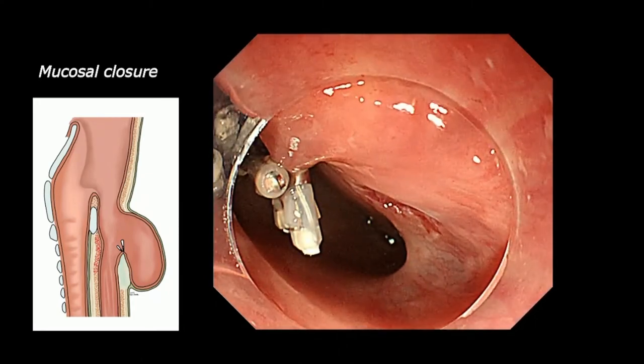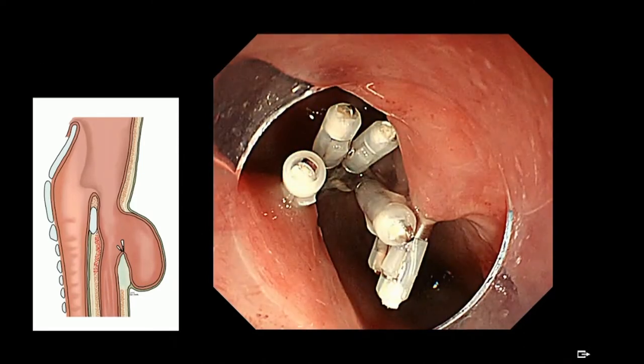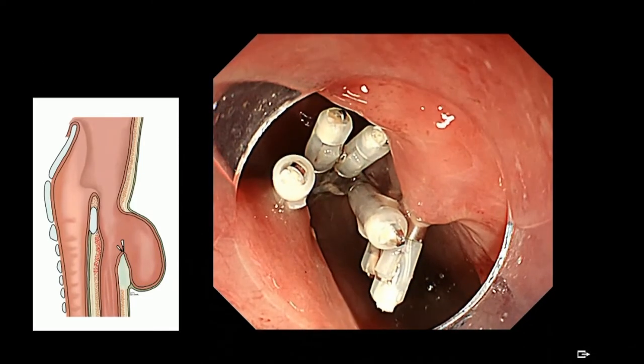We can see both the natural lumen and the diverticulum as well. After this procedure, the diverticulum opening is widely open. Of course, the symptoms resolve and the patient is satisfied very well.